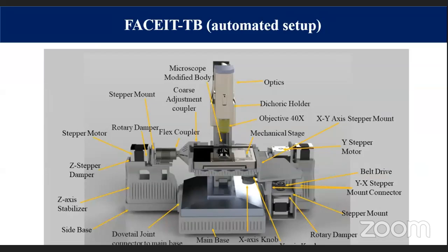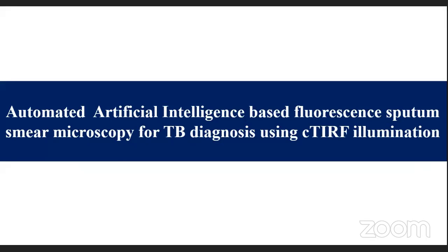Later on, when we were not working with the device and somebody else was working on it, we found that there was a difference when an expert was observing the sample in the microscope and when a naive or not very well trained person was observing it, because of lack of experience, especially with the fluorescence microscope and Mycobacterium tuberculosis.